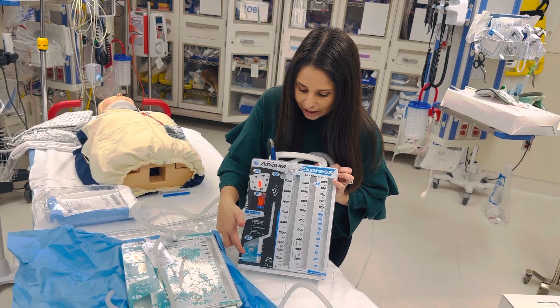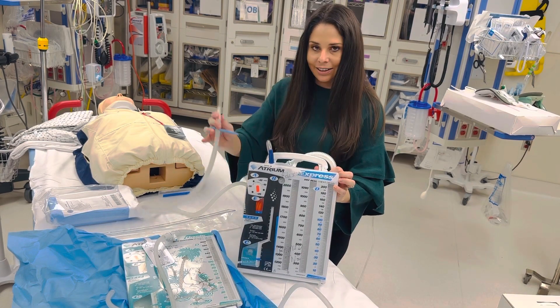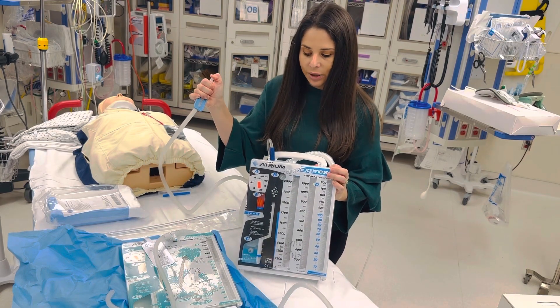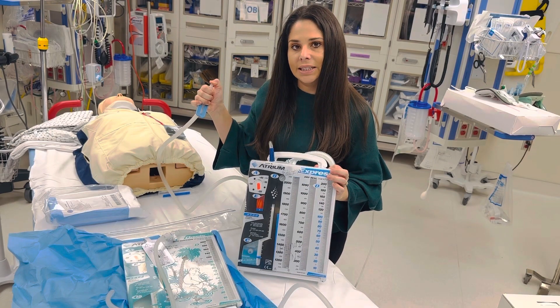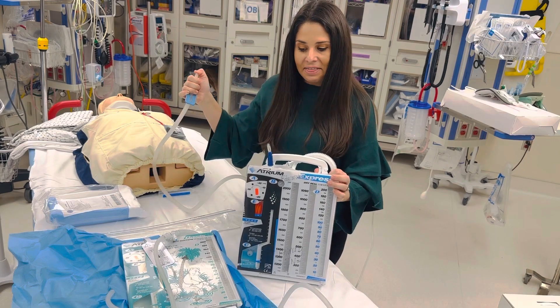I do have some leaking or bubbling down here because I have a massive air leak — this is not hooked up to anything. Notice how when I close this, my bubbling goes away. That means I have no more air leak and my chest tube is functioning appropriately. And that's your chest tube.